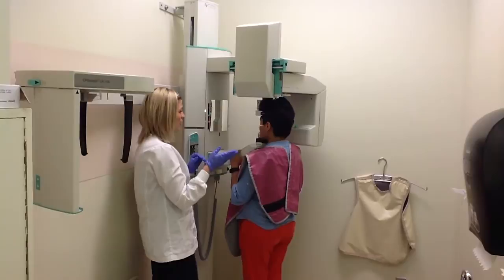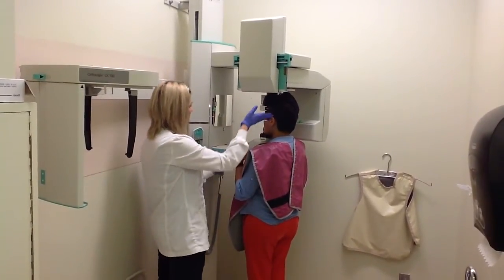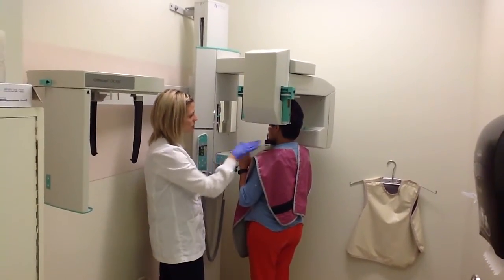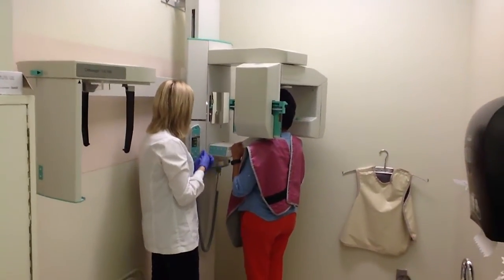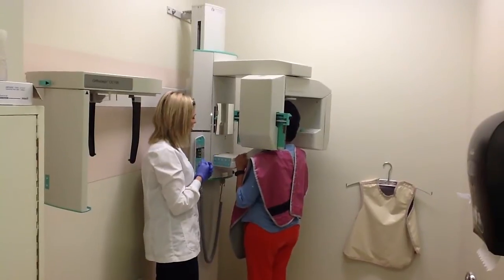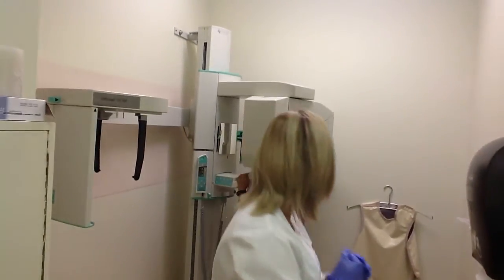Are you okay? Great. So tongue to the roof of your mouth, close your lips. Excellent. So this cassette is going to come down right beside your shoulder here. Don't be alarmed, it's not going to touch you. And you'll hear the machine moving around you. It'll make a little bit of a noise, and when it's done, I'll instruct you when you can move. Okay? Good job.